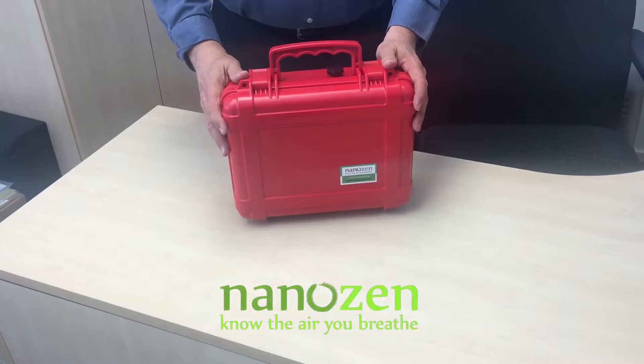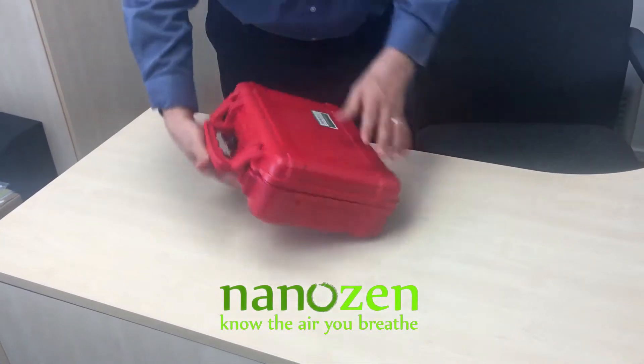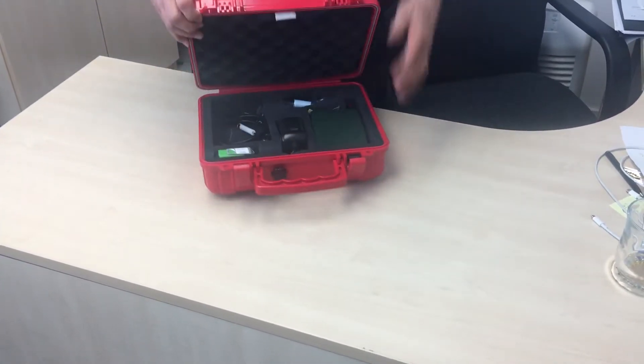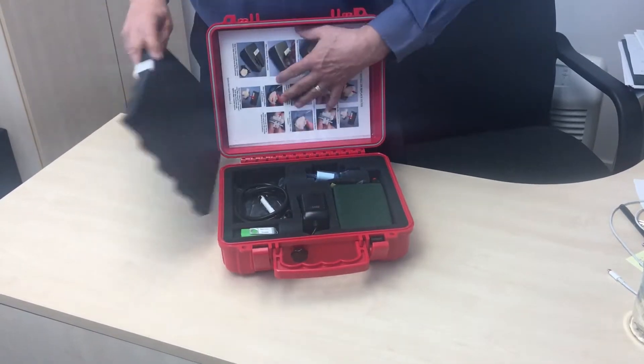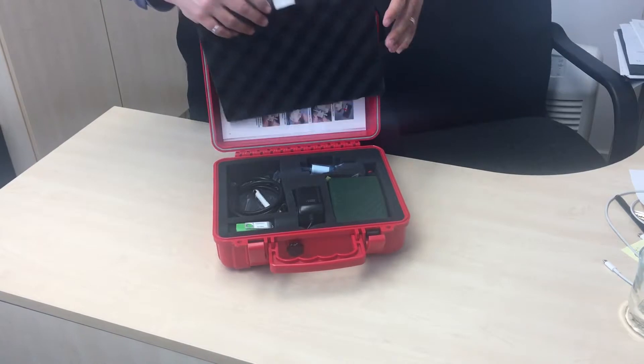This is the Nanozen single kit unit. When you open the case, the first thing is the quick start guide and the instructions. Any documentation is contained in the lid.